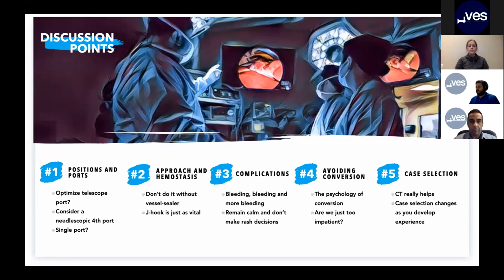We'll talk a little bit about complications, bleeding being the big one, but a few other things that we've seen over the years, and talk about the psychology of conversion a little bit. It's an interesting subject to think about. I may be guilty of not converting soon enough on some of these cases. But as experience grows, the idea would be that we try to get our conversion rate down. Not to say that conversion is not a valuable tool. We always talk about how conversion is a sign of good surgical judgment. But over time, if we can avoid the things that lead to conversion, like poor visualization and bleeding, that's going to help us out. It's going to give a higher proportion of our patients the chance to benefit from the advantages of this procedure. And then we'll talk a little bit about case selection at the end as well.